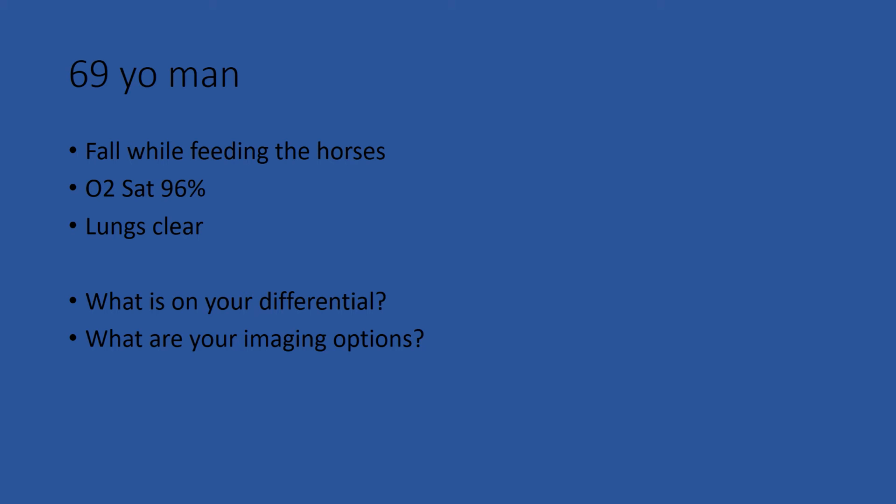If you have someone, especially if they're 2 weeks out, still having a lot of pain, and you're really trying to figure out whether they have a rib fracture, then a full rib series is an option. A full rib series does include a PA chest, posterior-anterior, shooting from the back towards the front, and a series of 4 or 5 other films at various angles looking to see whether or not there is evidence of a fracture.